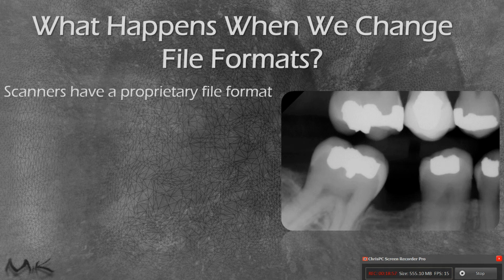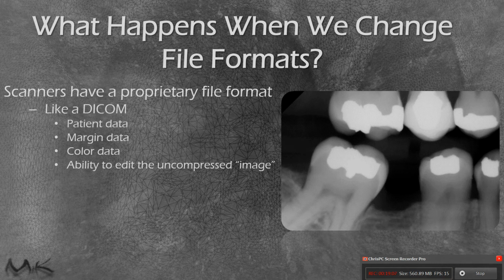So what happens when we change file formats? As I said, scanners have a proprietary file format attached to almost every manufacturer. So an easy way for me to explain this if you're new to the digital scanning world is like a DICOM image. So when we have our digital x-rays and we save a DICOM image and we send that DICOM file to another dentist, they have the ability to have the patient data, they have the ability to change the contrast, change the KVP, change the MA, and really play with that image as they see fit.